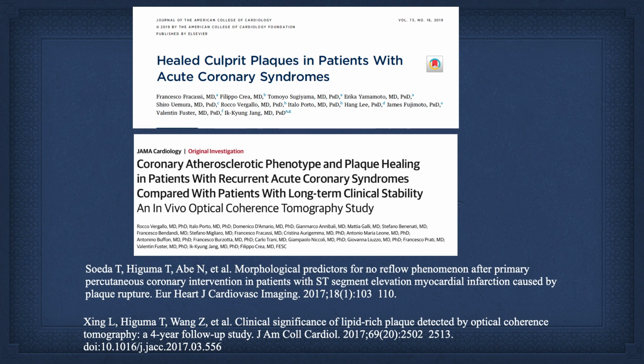Now, people link our conclusions to these papers, and from these papers, the only thing that I got personally was that if you looked at their cores, two of them have to deal with, quote, healing, and I'm going to question whether they're looking at healing or not, or whether you can say that confidently. And two of them didn't, the two on the bottom. But on the top paper, these healing papers, to my read, the first paper says patients with healing you have to treat them more aggressively with their, quote, healed plaques.